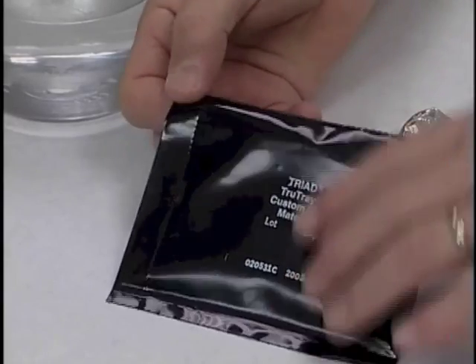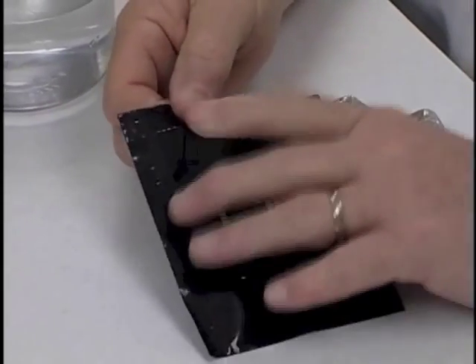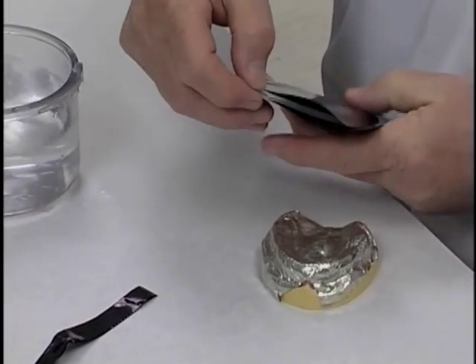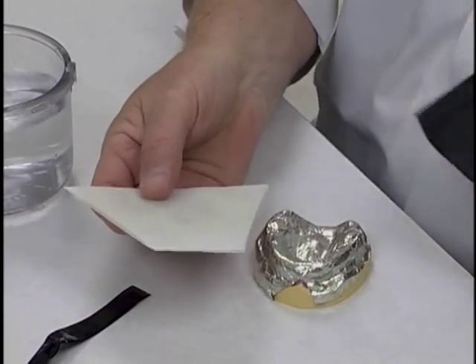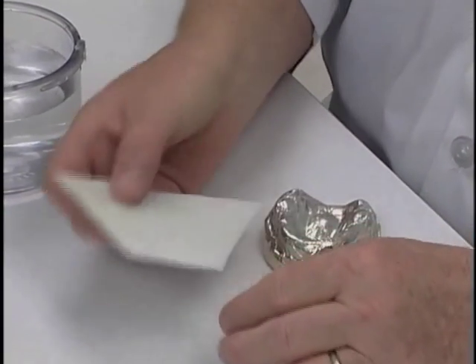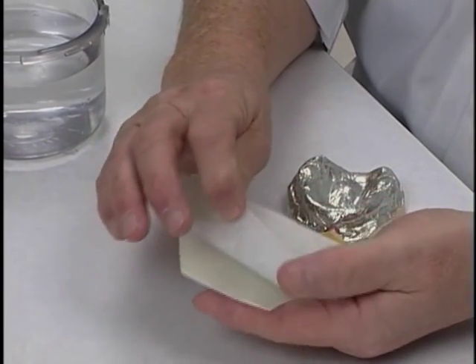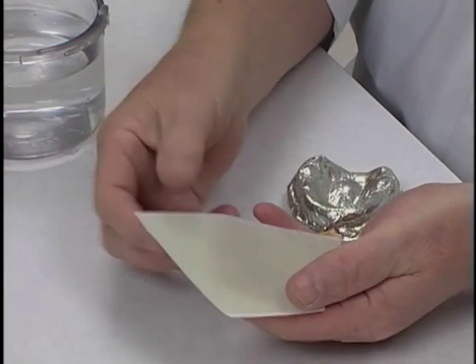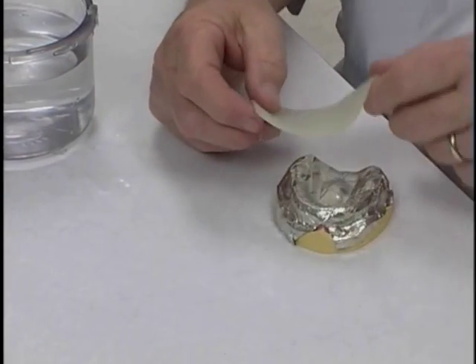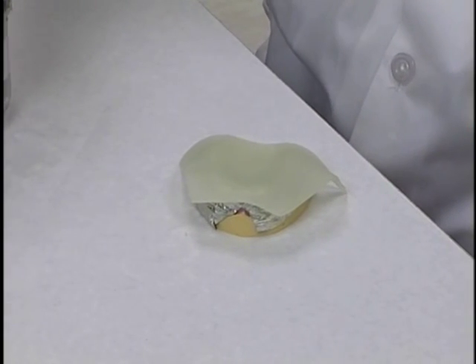The material comes in a black package, much like photographic film used to come in black packages to keep it from being exposed to the visible light. So the material itself has paper on either side of it, and the way that we use the material is to take the paper from it, and now we're going to adapt that to the cast over top of the tin foil.